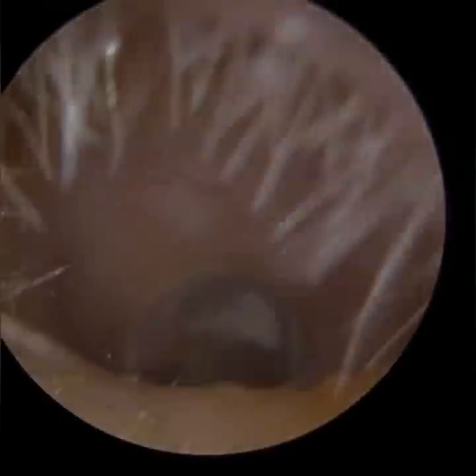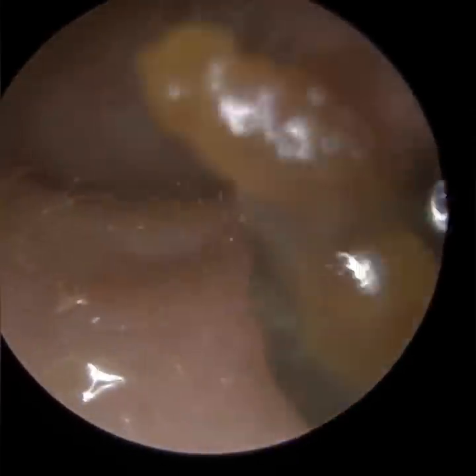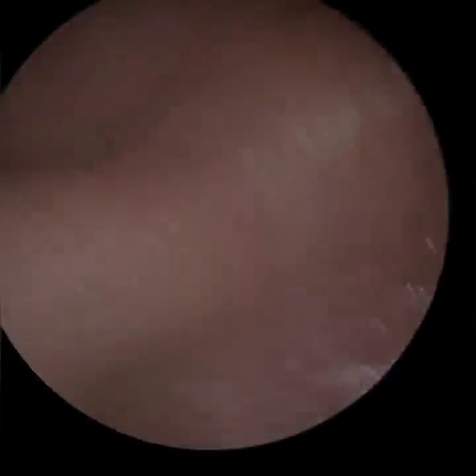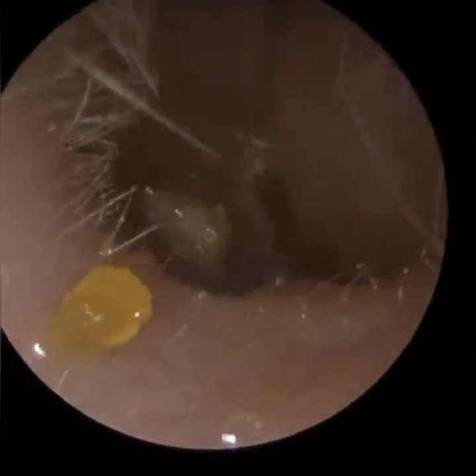This is patient two. The wax came up relatively easily, but you can even see it here – the endoscope's not even near yet and you can already see they've got some posterior myringosclerosis. When we show it back to patients, they're often worried if it affects their hearing. As I said, if it's exclusively on the eardrum, typically no.